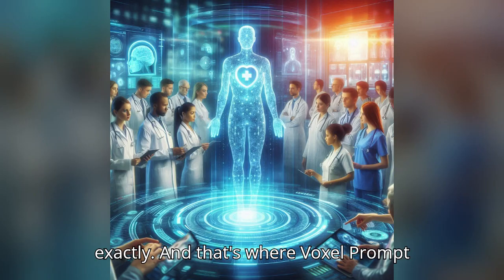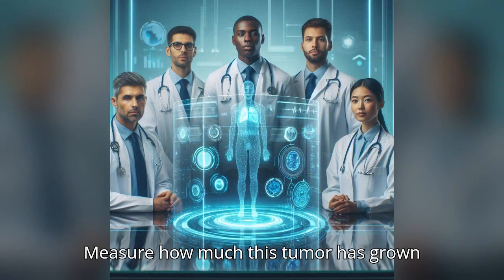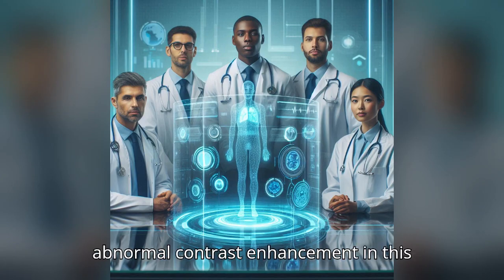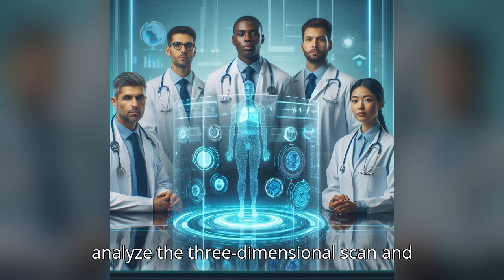And that's where Voxel Prompt comes in. It aims to be that versatile multi-tool for medical imaging. You just give it a text prompt like, measure how much this tumor has grown since the last scan, or is there any abnormal contrast enhancement in this area? And it uses its AI smarts to analyze the three-dimensional scan and give you the answer.